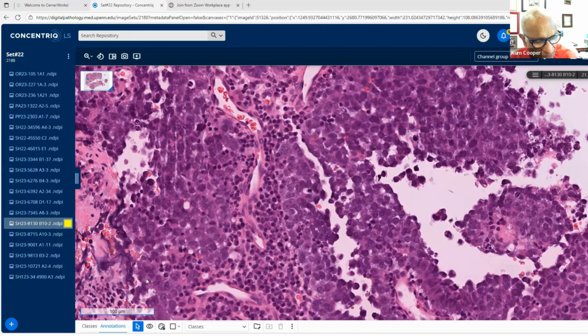That is diffusely keratin positive. It also has this abrupt squamous differentiation and peripheral palisading, but it has the same translocation, with CD99 diffuse membranous positivity. This one is CD99 negative. Okay, so we have a panel that can address all of these differential diagnoses.